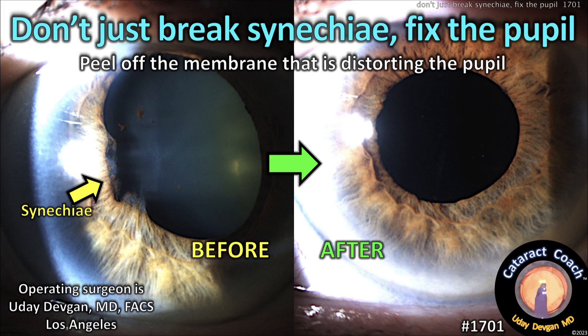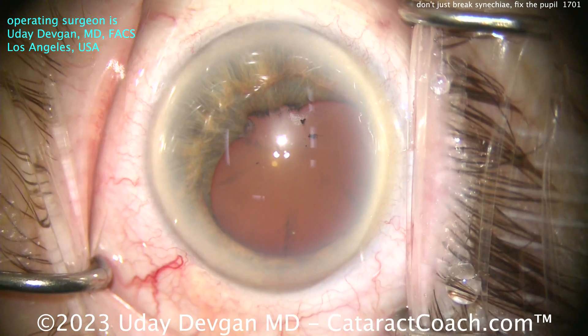cataractcoach.com. Don't just break the synechiae — fix the pupil. You can peel off the membrane that's distorting that pupil. Let me show you a case here.